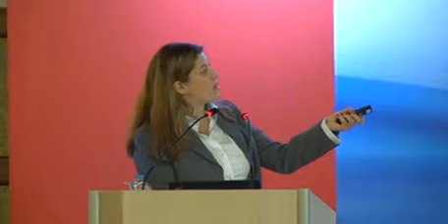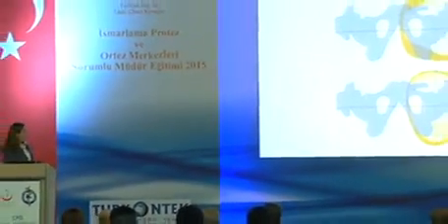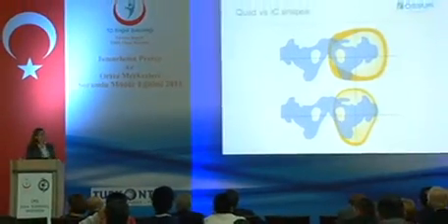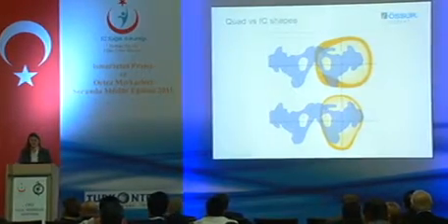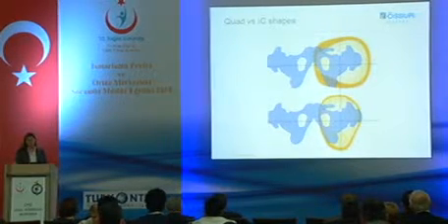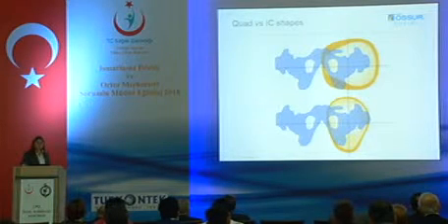When we look at the two designs side by side, so looking from above, what we can see is that with the quadrilateral socket, we have a much wider ML, so we're actually distorting the natural shape of the thigh and trapping the musculature in this unnatural position. Burada gene her iki soket tipini de yan yana karşılaştırdığımızda kuadrilateral olanın mediolateral olarak daha geniş olduğunu ve bu anatomiye çok da uymayan yapı içerisinde yumuşak dokuların sıkıştırıldığını görüyorsunuz.